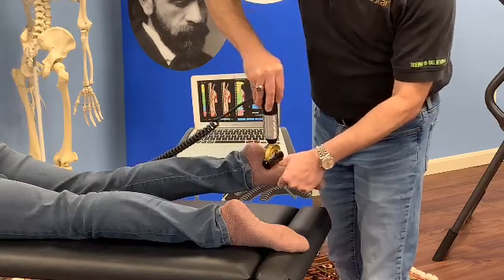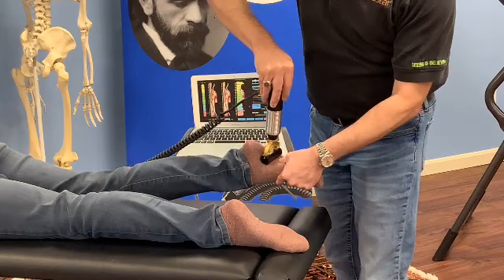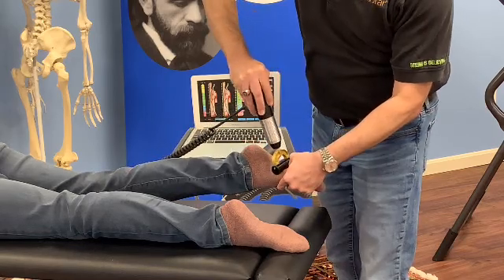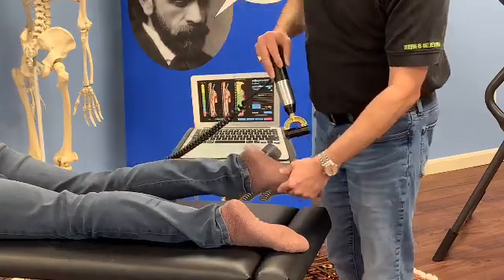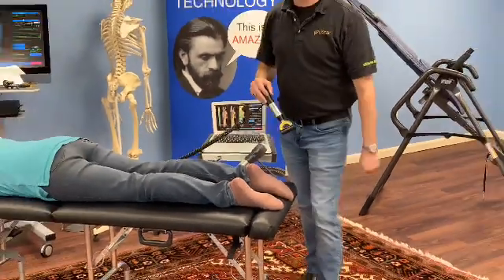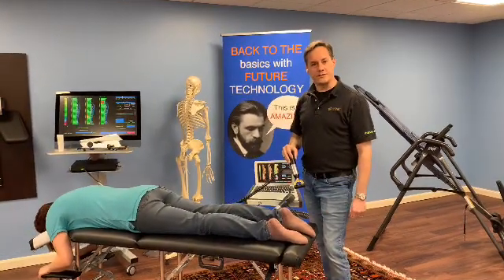If you happen to feel a little speed bump, we can work along that area and focus the multiple impulses right in that spot as well. And that's it — a quick, easy way to work with plantar fasciitis patients and get some really great results with extremities.